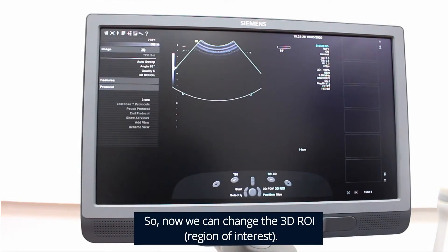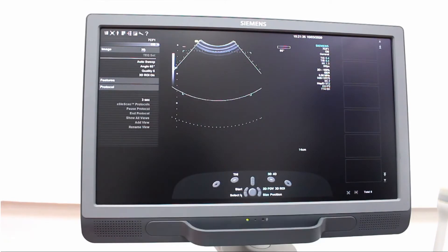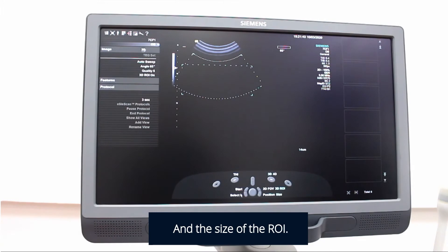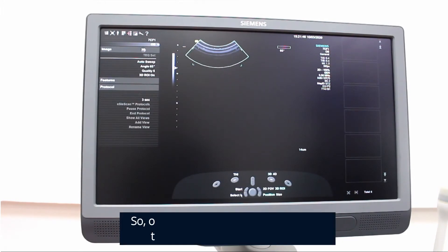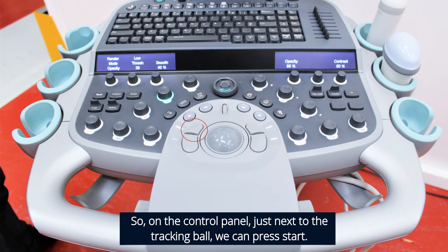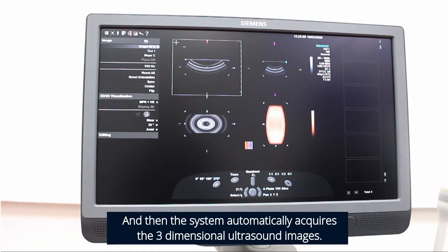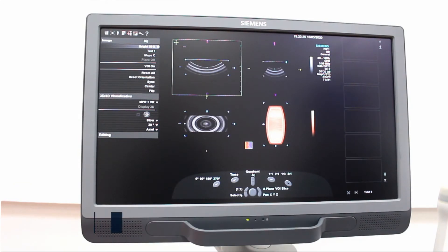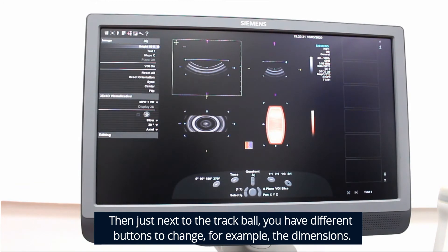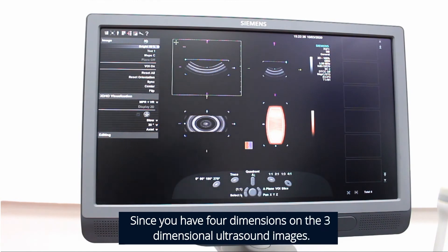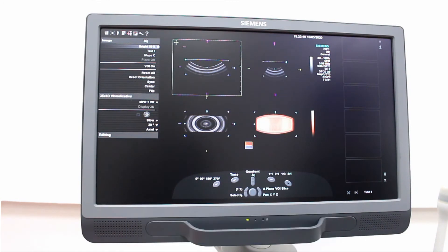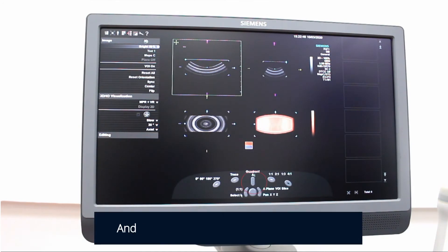Now we can change the 3D ROI and the size of the ROI. On the control panel, just next to the trackball, we press start and then the system automatically acquires the three-dimensional ultrasound images as shown on the screen. Next to the trackball you have different buttons to change, for example, the dimensions — you have four dimensions on the three-dimensional ultrasound images — and you have four quadrants you can choose.